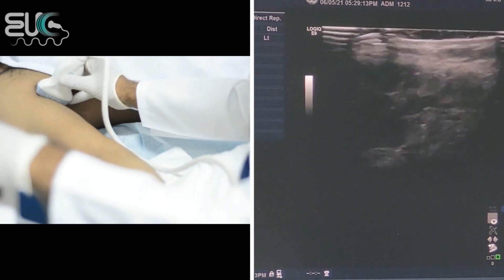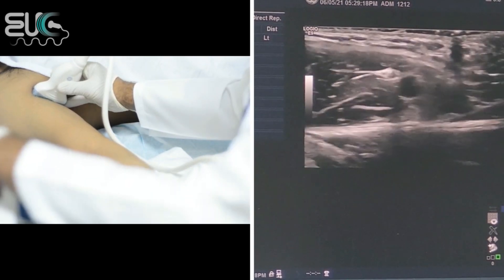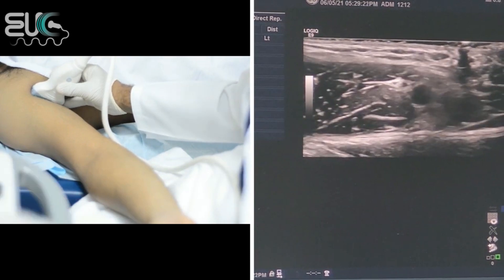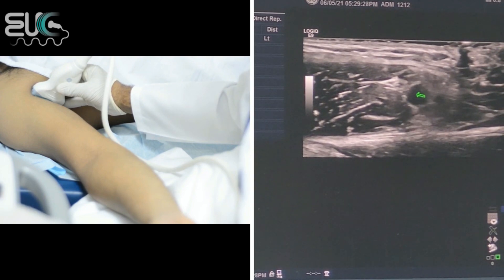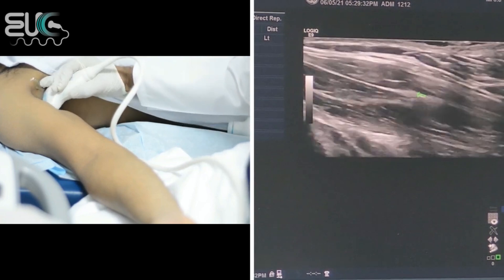Here at the axilla, I will try to locate the axillary artery. I think now I'm over it. As you can see on the screen, we have the axillary artery which is pulsatile. I will scan it on the sagittal plane.